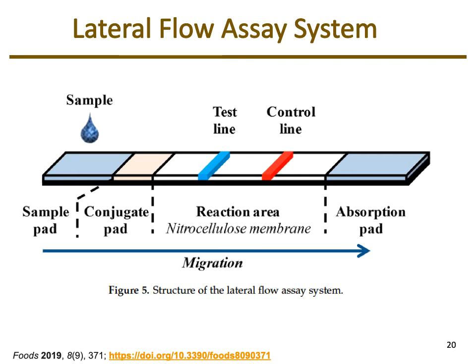So different substrates are added in there, that test line and the control line. And so again, if the sample has bound to the antibodies, because maybe these antibodies are to Salmonella, and Salmonella has now moved through, or proteins from Salmonella have moved through, when they move to the test line, you would get a color change because that antibody has a component that's going to react to that substrate.